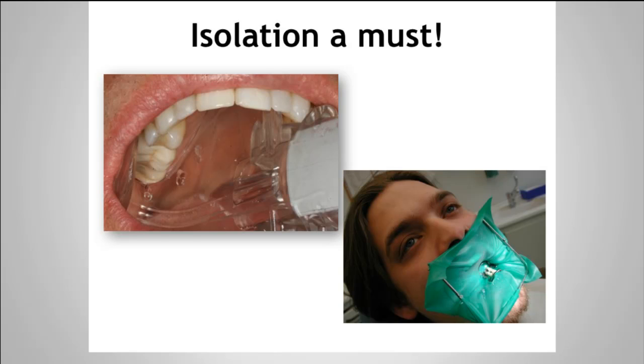As we all know, the gold standard for a long period of time has been the rubber dam. Am I here to say it's not the gold standard anymore? Absolutely not. I still think a rubber dam is definitely where the bar should be set in terms of adhesion dentistry and doing adhesive dentistry in a controlled environment. I personally use Isolites a lot. I use that system because of the ability of my patient adaptation to it and the overall effect that I get with it, and the ease and the comfort of it. And I think we can really say to ourselves that maybe it's not the gold standard of a rubber dam, but it's pretty darn close in terms of how well it works in certain situations.